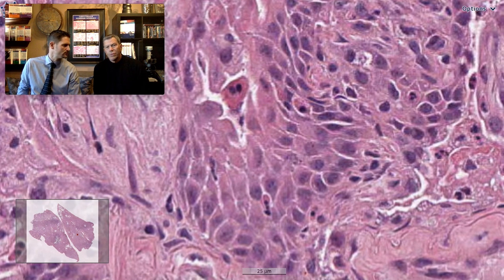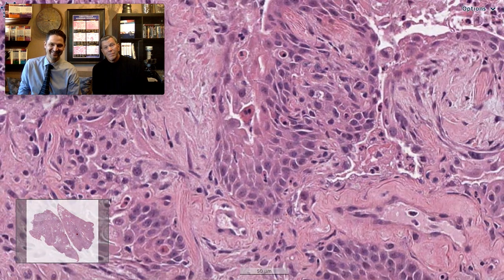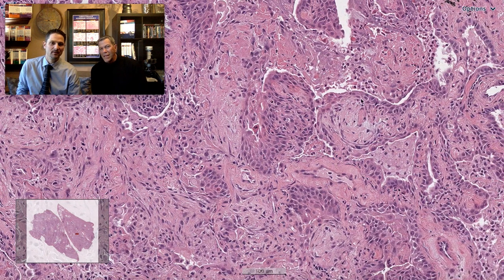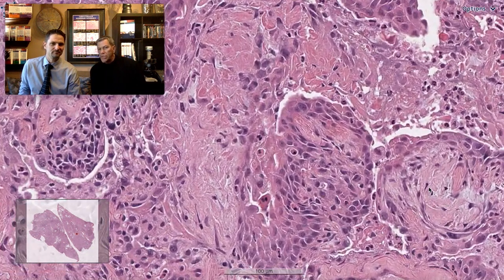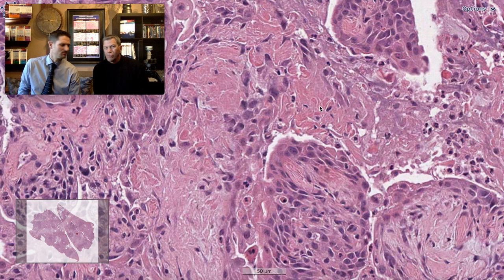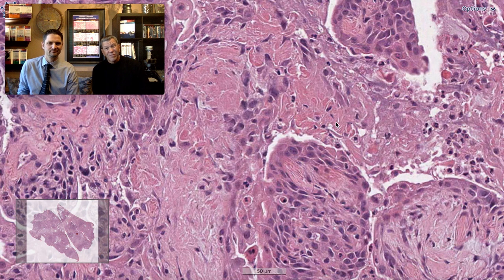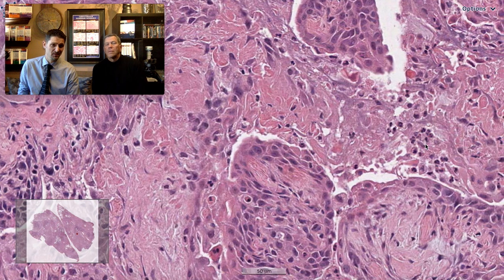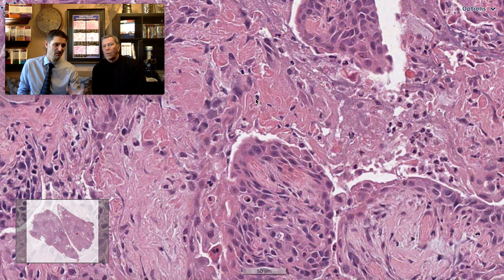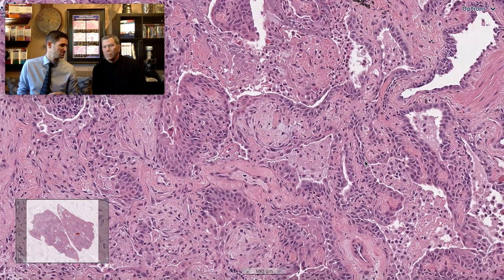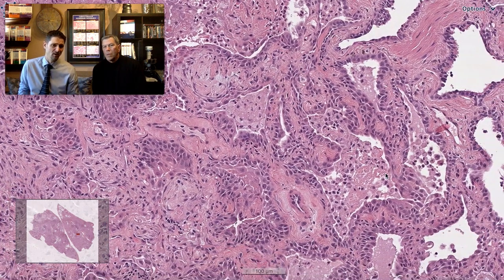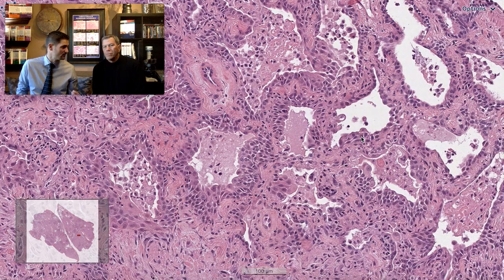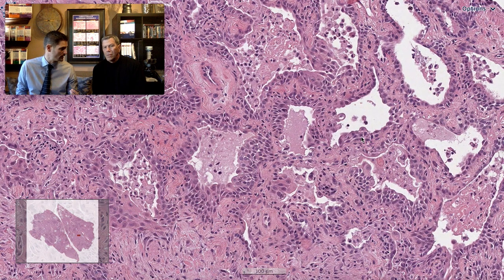Maybe we should show it to our cytopathology friends — that might be a mistake, they might be a little nervous. But I think we can surmise that this squamous epithelium is here as a reactive process. Because what's right above it here? Looks like fibrin — extensive fibrin and a little bit of inflammatory cells. So we have abundant fibrin, polyps of organization, organizing pneumonia. This type of squamous metaplasia, which can be very atypical appearing, almost look dysplastic, is one of the expected histologic findings of the acute lung injury pattern.